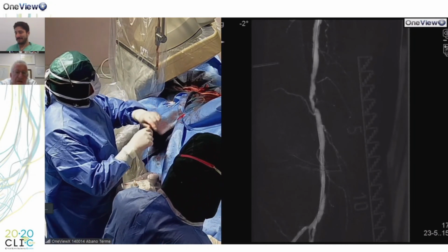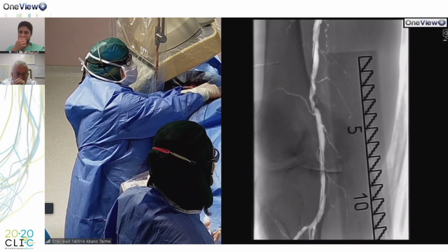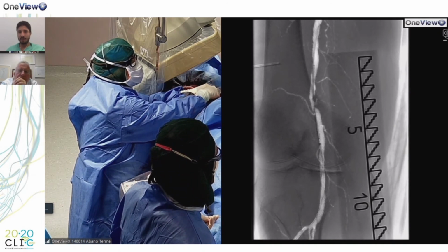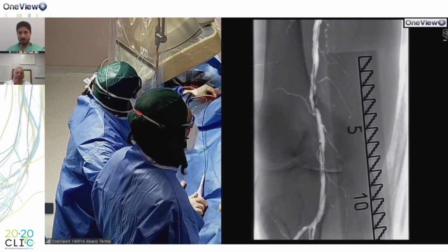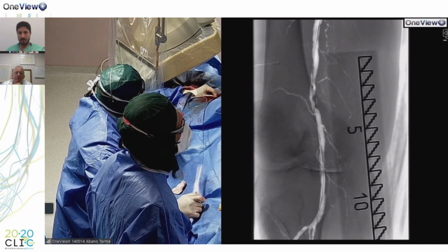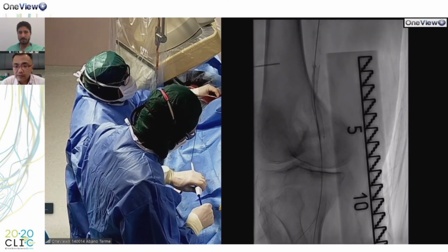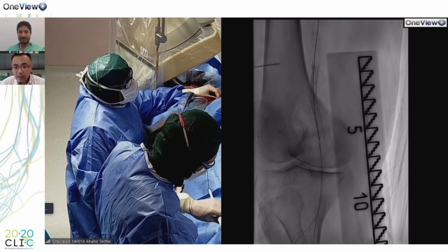Okay, now we are going to follow Steven's suggestion, and we deploy. So primary stenting. Yes, we will deploy the Eluvia stent first. Marco, this is a 6 centimeter stent? It's a 6 millimeter. For length? 60. 70. 60. And now we proceed.